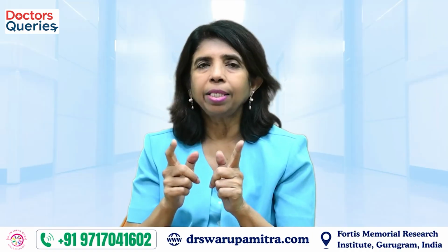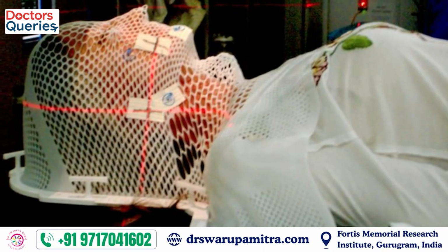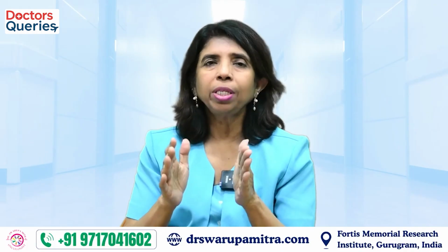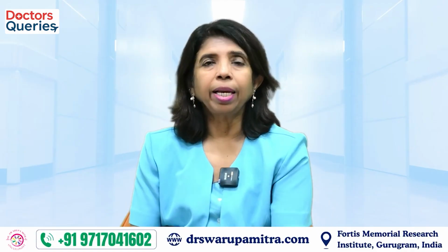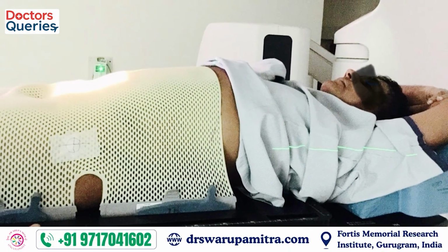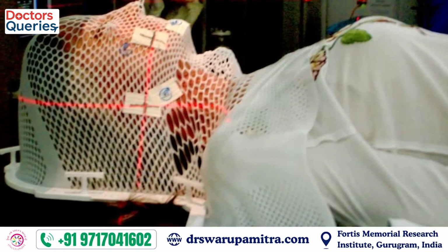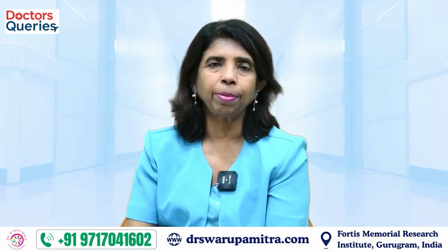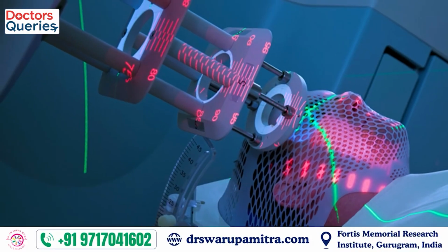The patient is made to lie on the simulator machine wearing a mask. What is a mask? A mask or a cast is made proportionate to the patient's body, the part where we want to treat the patient. Like if the patient is being treated for a pelvic cancer, then the cast is made of the pelvis. If the treatment is for the head and neck area, the mask is made for the head and neck. This mask the patient wears during the treatment. The purpose of the mask is that the patient does not move during the treatment.